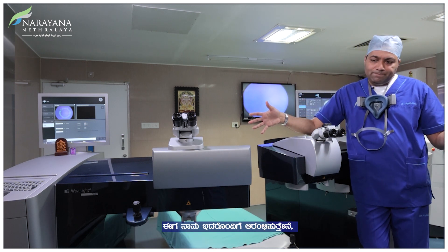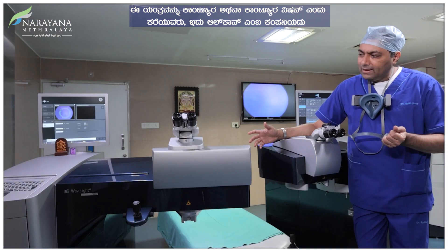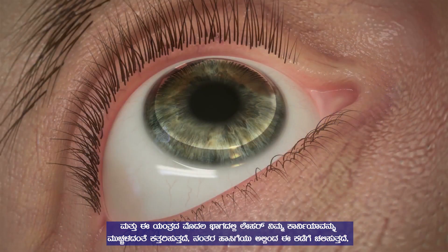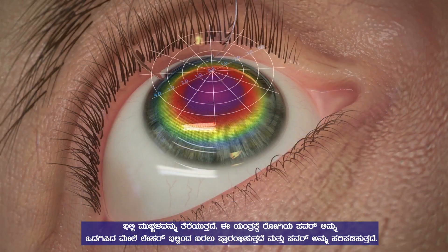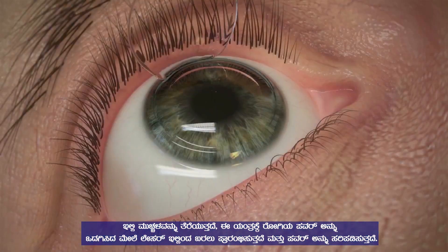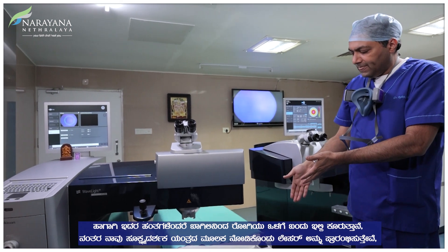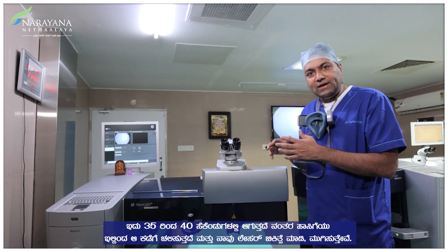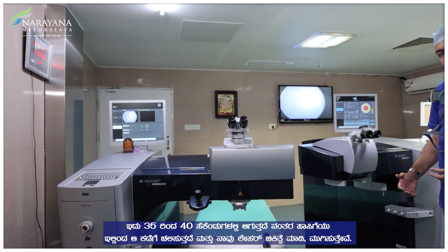Let me start with this one. This is a machine called Contura or Contura Vision. This is from a company called Alcon. The first part of this machine makes the laser which cuts your cornea and makes the flap, and then as the bed moves to the other side, the laser delivery happens and the power is corrected. When the patient comes inside, he sits here, the laser is given while we look through the microscope. It takes around 35-40 seconds, then the bed moves to the other side and we do the laser.